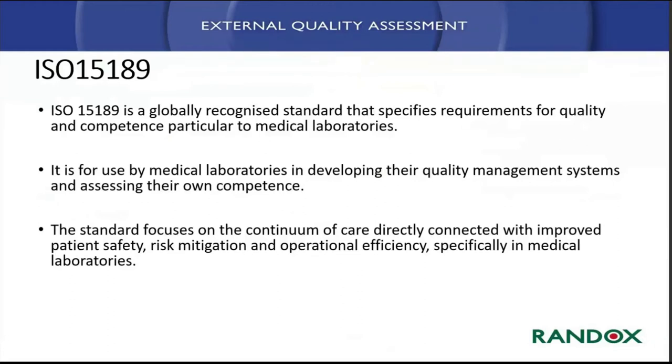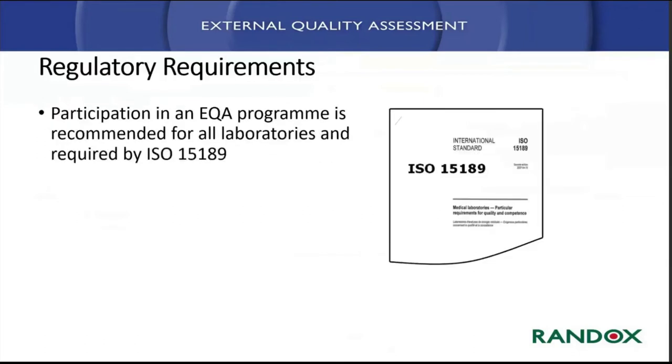with this, the ISO 15189, which is the globally recognized standard, which specifically looks at quality and competency in the medical laboratory. It's there for you to use to assess your own competency, and it really focuses on improving patient safety, reducing risk, and increasing operational efficiency. The important thing to note is that participation in external quality assessments is recommended for all laboratories, and it is actually required by those that are looking for accreditation to ISO 15189.